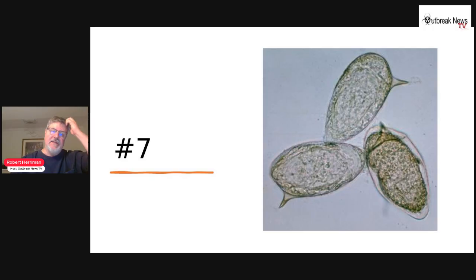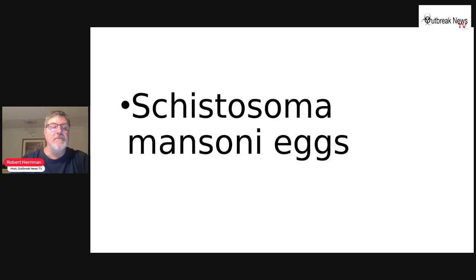This is pretty classic, and most people watching should have this one pretty much in the bag. And the organism is Schistosoma mansoni eggs. Of course, one of the causes of schistosomiasis, one of the most common and devastating parasites globally. All right.